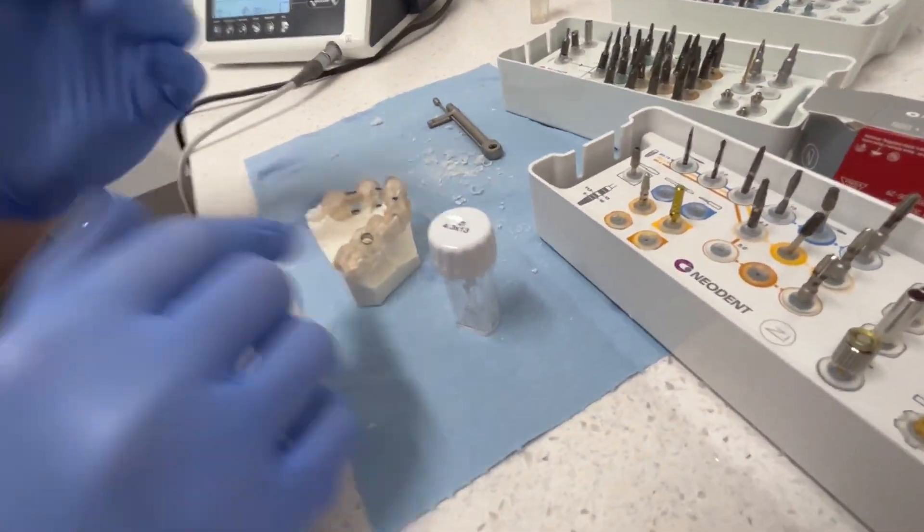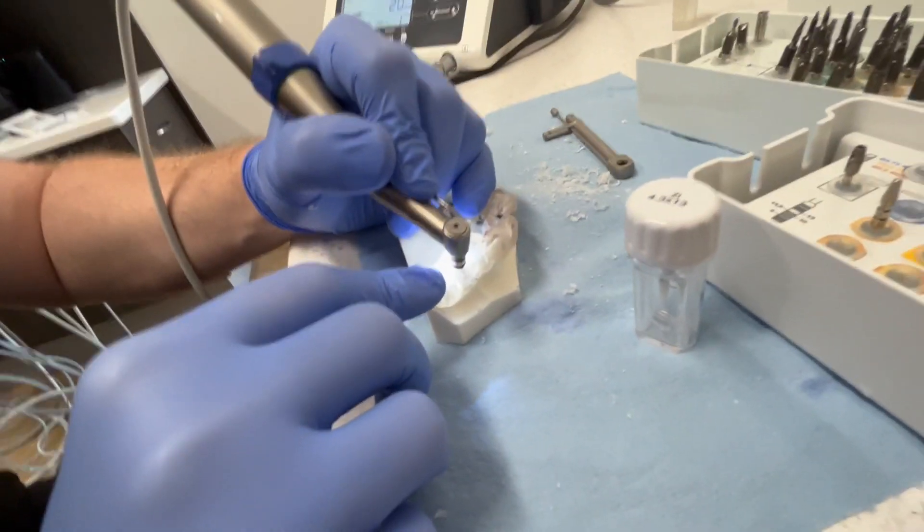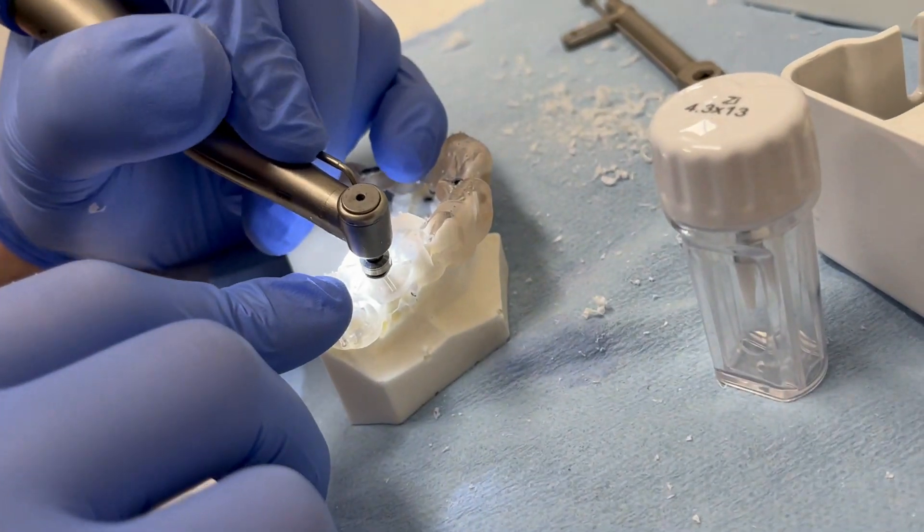So first we start with our... Same thing, pump and relax, pump and relax, just getting it down to the stop.